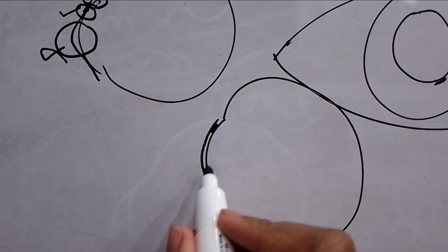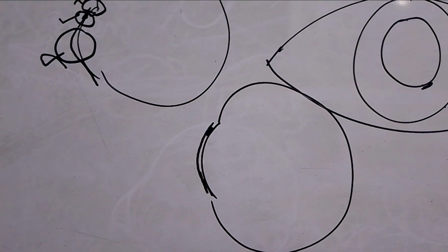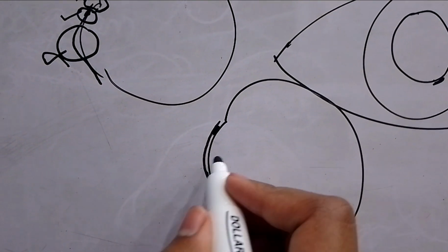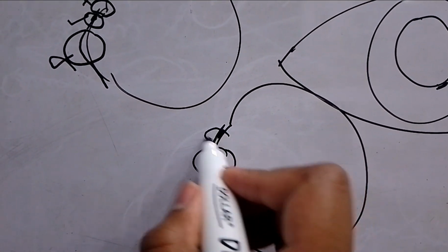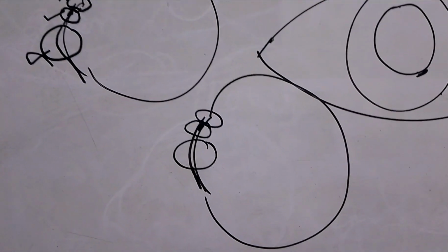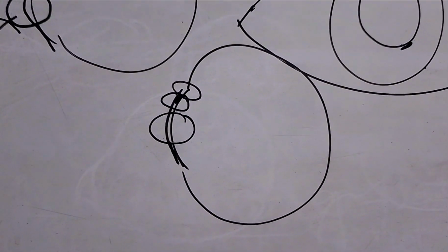So you can see here in this picture the actual thing which I want to tell you: the apex should not be in touch, there should be a mid periphery touch, and the edges should not again be in touch. So this is the aligned contact lens.